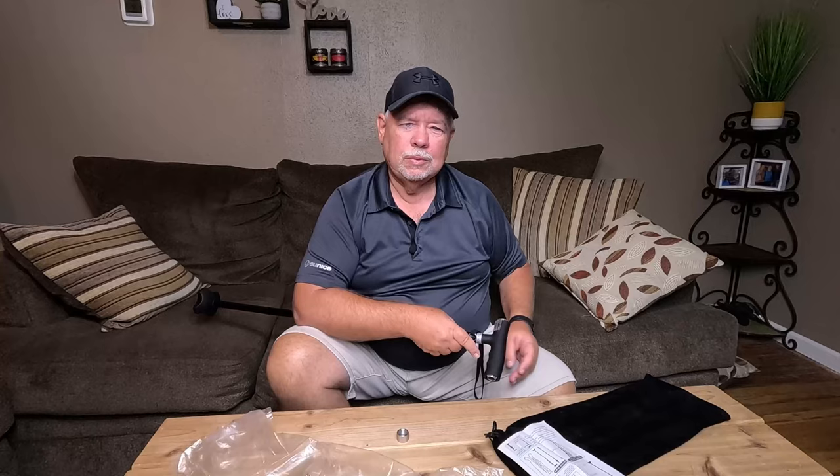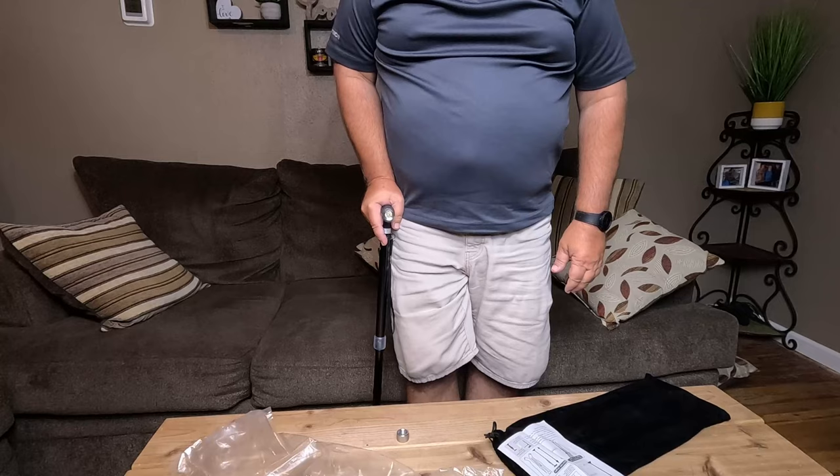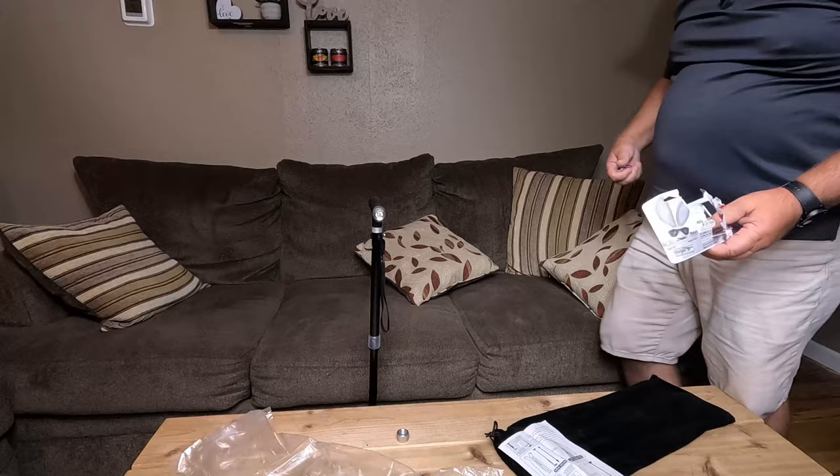Let me get some batteries put in it and let's check it out. Get that thing adjusted — you want it where you can take the weight off your leg. It stands by itself too. Let me grab some batteries. Oh well, I just happen to have two, and that's all I have — I'll have to put that on my list.